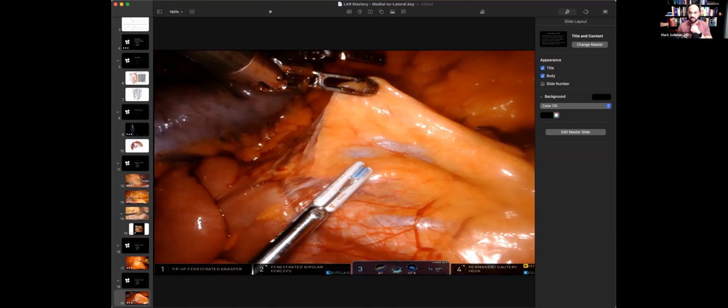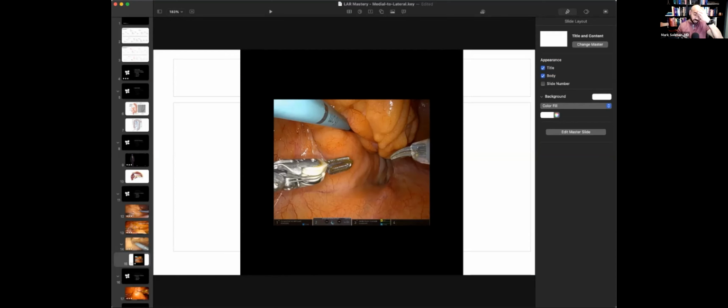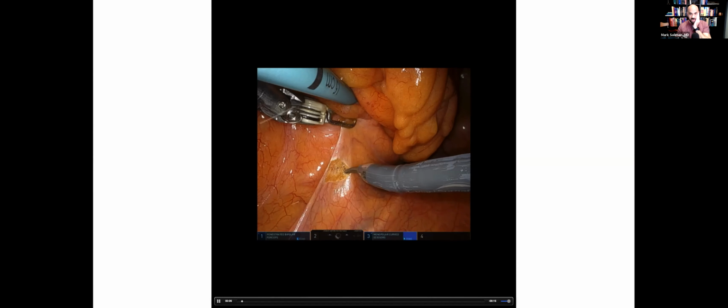All right, this video, not very good, but it'll show the point. Actually, you know what? Let's do this. I'm gonna show this video. Okay, I'll play this video again. I have plenty of mess ups, but I think this video that I showed that I borrowed is probably actually a pretty good one to show this. So let me show you what I would normally do.